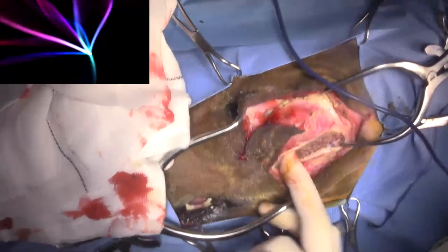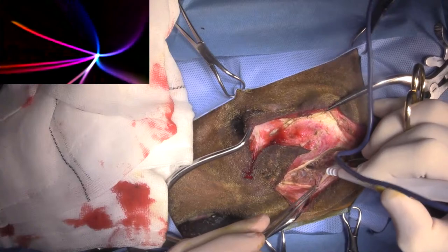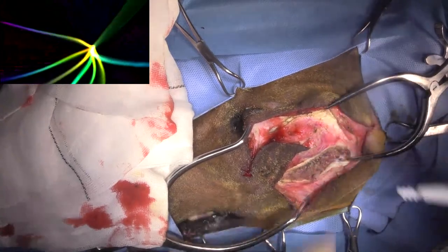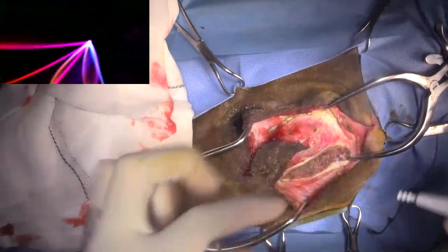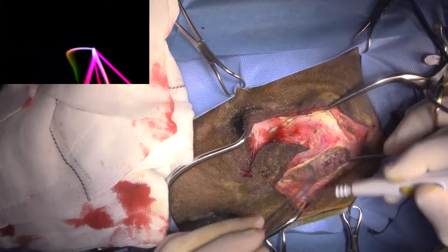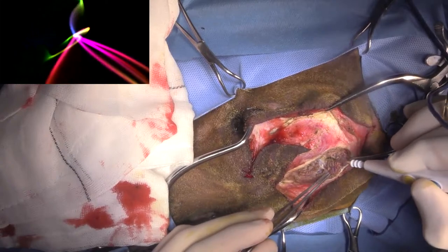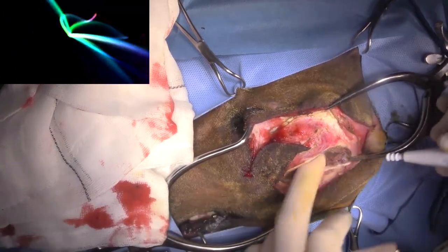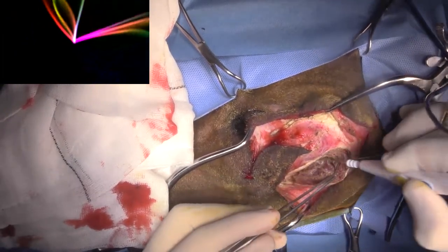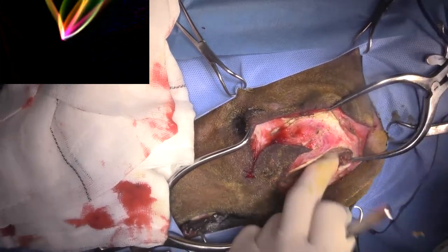Getting down to the ventral aspect of the zygomatic arch into the orbit down here. Question about the prognosis of this case post-removal? So the prognosis, as long as we get a clean margin on it, is quite good. The metastatic rate with facial fibrosarcoma and fibrosarcomas in general is about 20%. And this did come back a lower grade tumor.